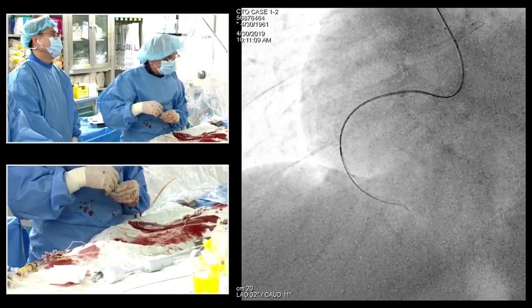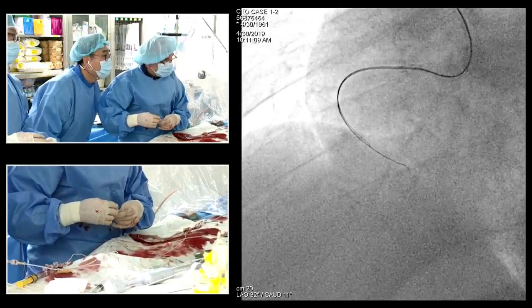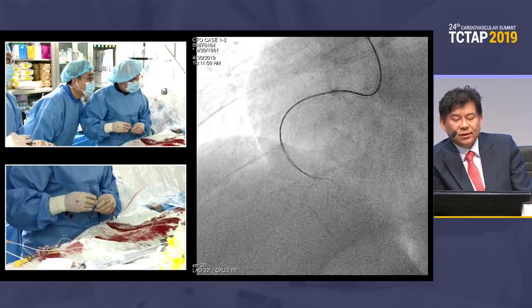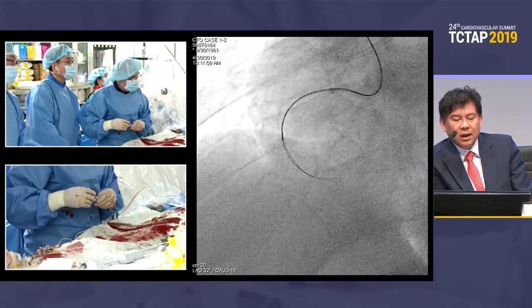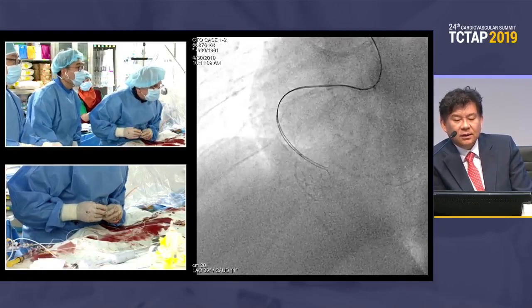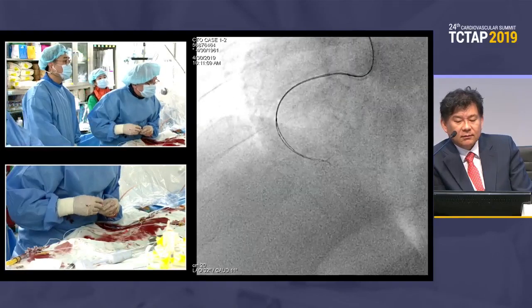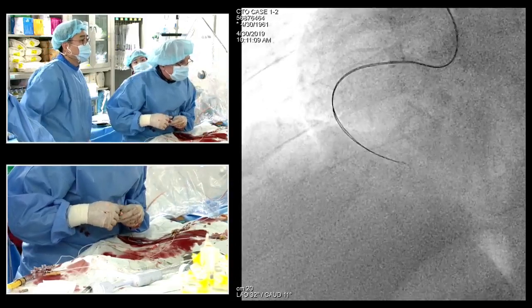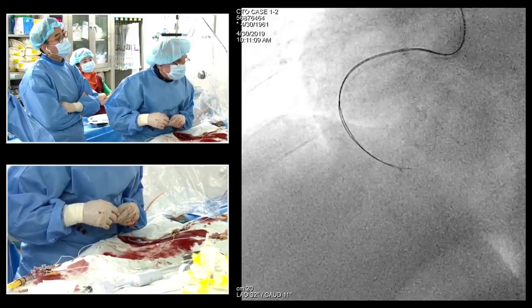Dr. Asakura. So personally for me, if I tend to make a dissection beyond the PDPL bifurcation, I will not hesitate to switch to the retrograde because this distal bifurcation is very important. If you could enter before the bifurcation maybe that will be fine. No, well, I want to enter at the distal cap. I don't want to do a re-entry here. I was, of course, thinking I'm very close for ADR, but the resistance is extreme. I have to do a lot of dilatation here.